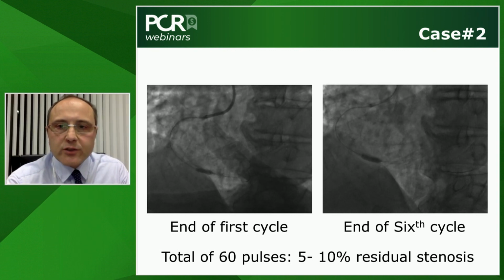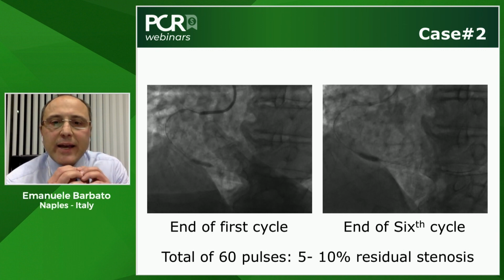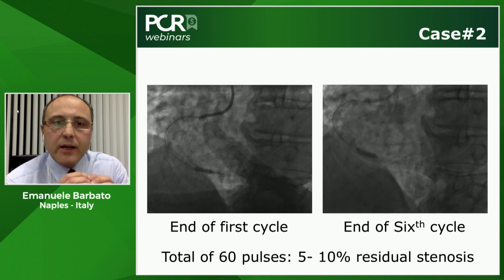And the second question, which is interesting, and it came from one of our colleagues, is there any interference of your buddy wire with the pulses you are delivering to the stenosis?